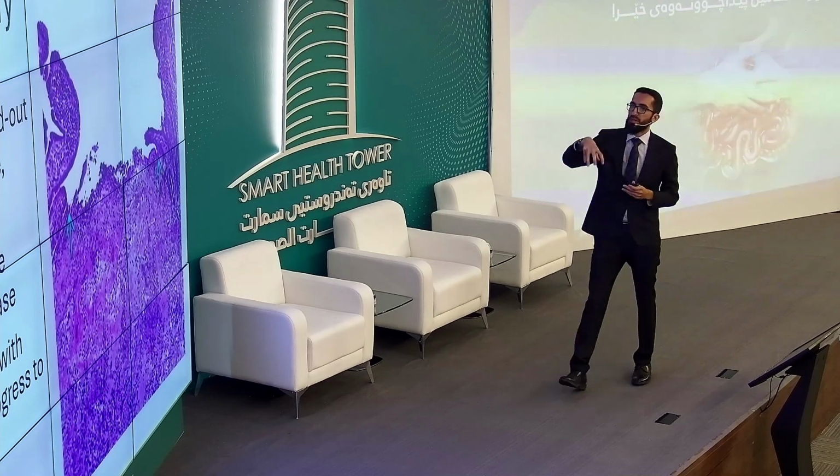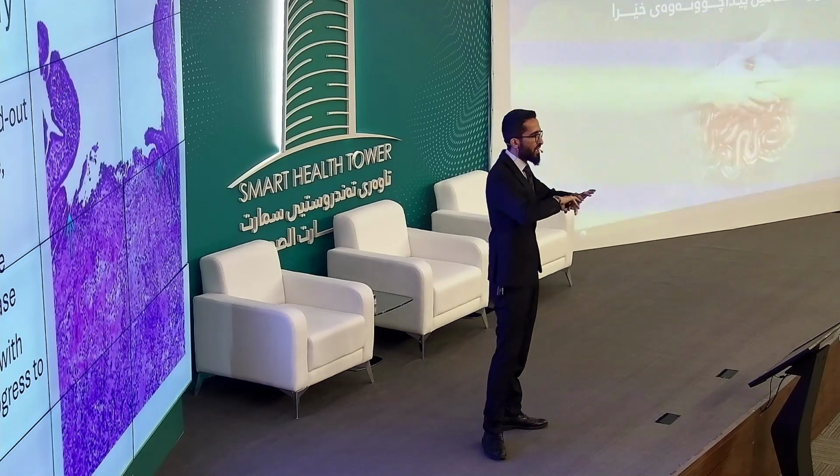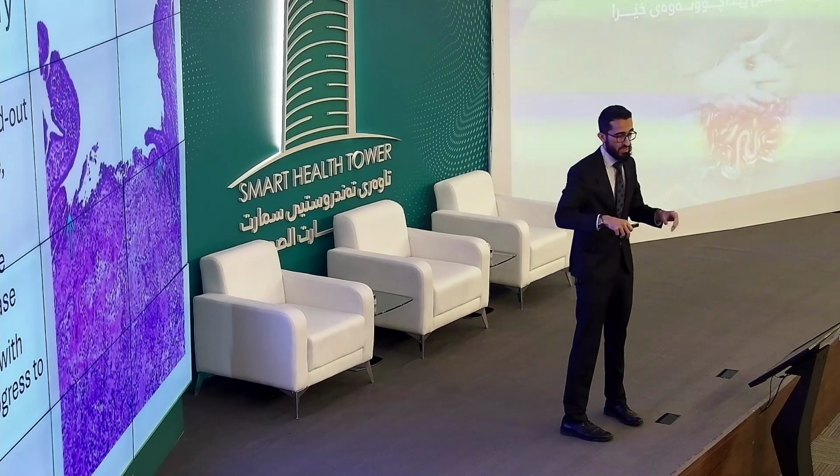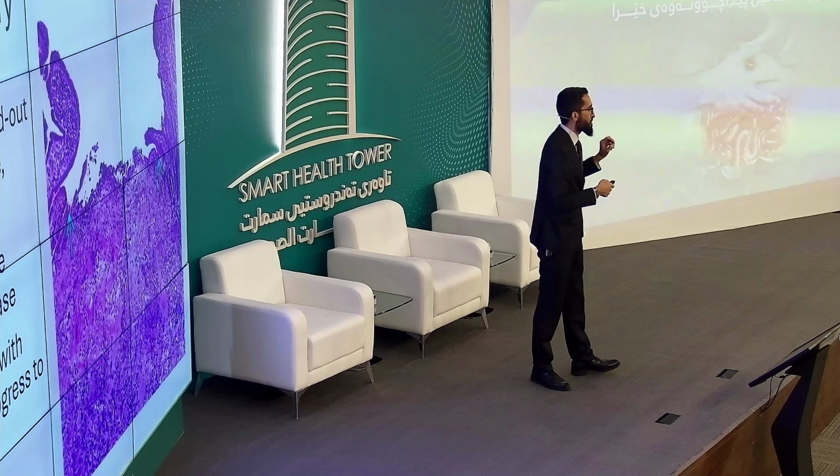Now, regarding drug injury, NSAID-induced injury can cause aphthous erosions like we see in early Crohn's. They can cause punched-out ulcers. Now, the pattern is different. It doesn't cause a pattern of chronic active ileocolitis histologically that we saw with Crohn's, but it is important to stop NSAIDs before you make a diagnosis.